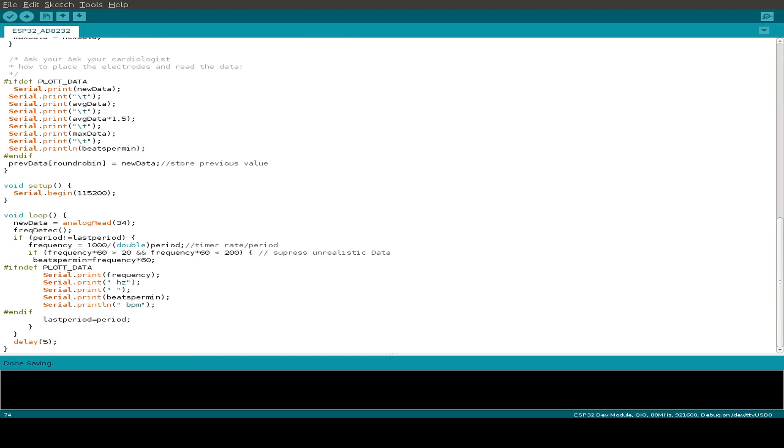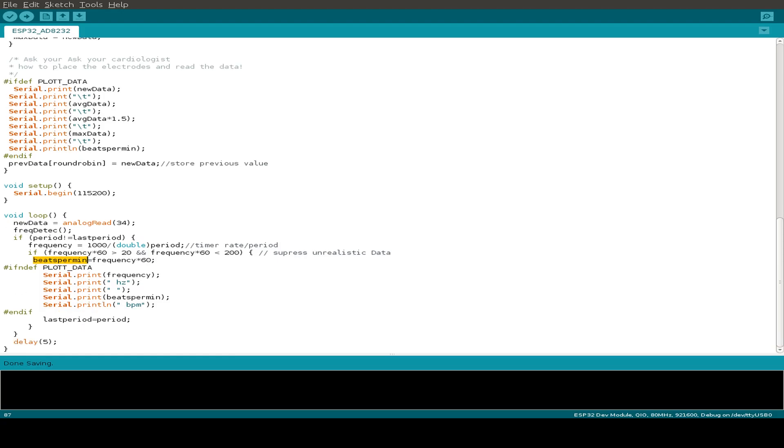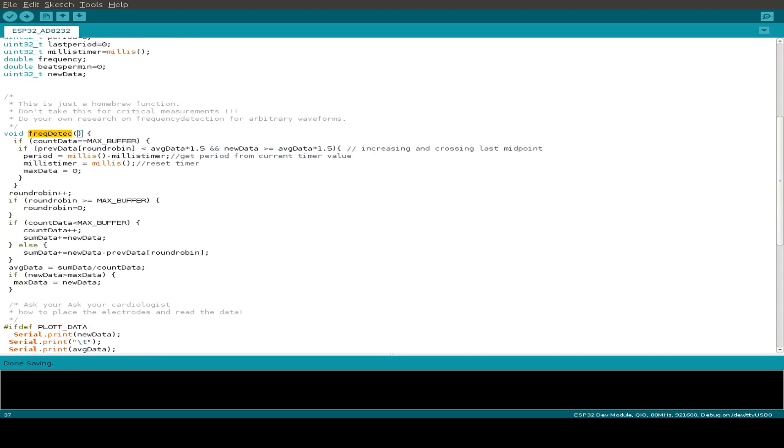Let's have a look at the Arduino code — it's just a small code. In the setup function we initialize the serial output, and in the loop function we just read GPIO pin 34. It's an ADC-driven GPIO, so we use the analog read function to collect the output data from the AD8232 chip. Then I call a frequency detection function to process the read data, and we can also calculate the heart beats per minute, but this is just a homebrew function, so don't really trust the beats per minute calculation.